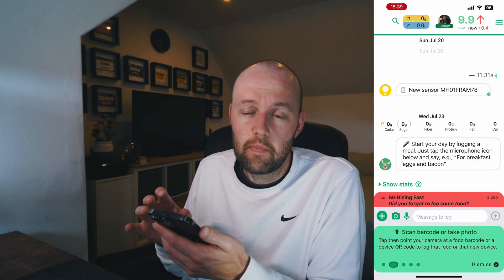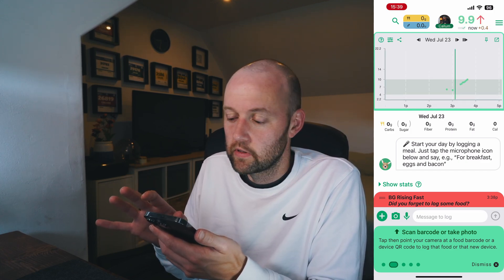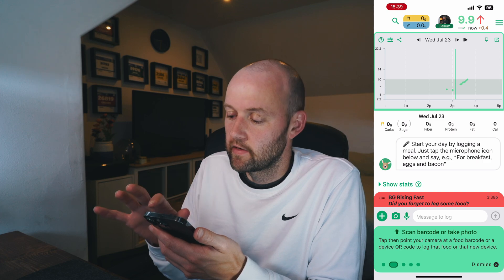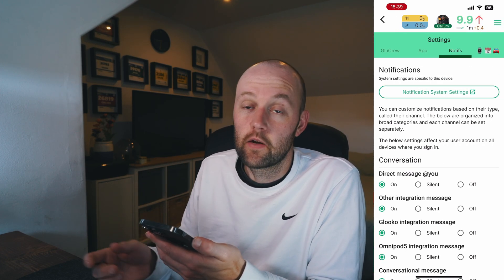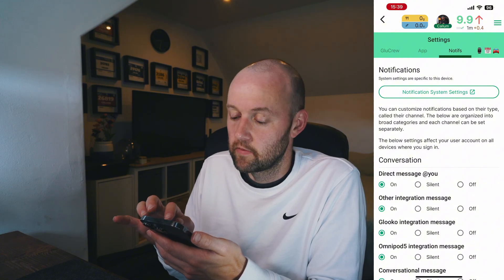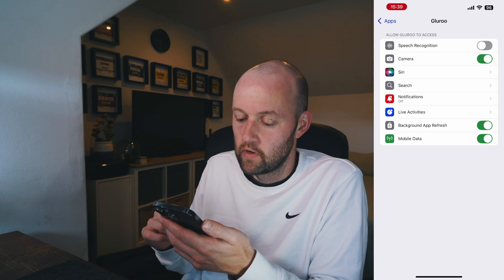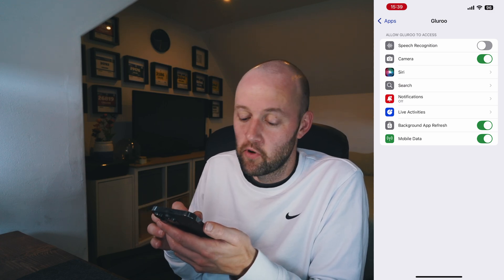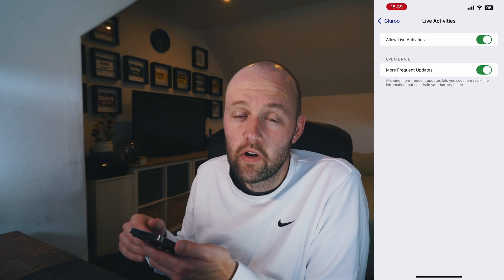This is the GlueRoo app. If you click on your blood glucose at the top right-hand corner, you can see a little graph of what your blood glucose levels are doing. What we're going to do is go to the settings — the menu button on the top right-hand corner — and click Settings. Here we're going to go to notification system settings, which will take you to your settings for the app on your phone. Then go down to Live Activities and turn them both on. Once you go back to GlueRoo, hopefully if you show your lock screen, it will then just be displayed at the bottom.